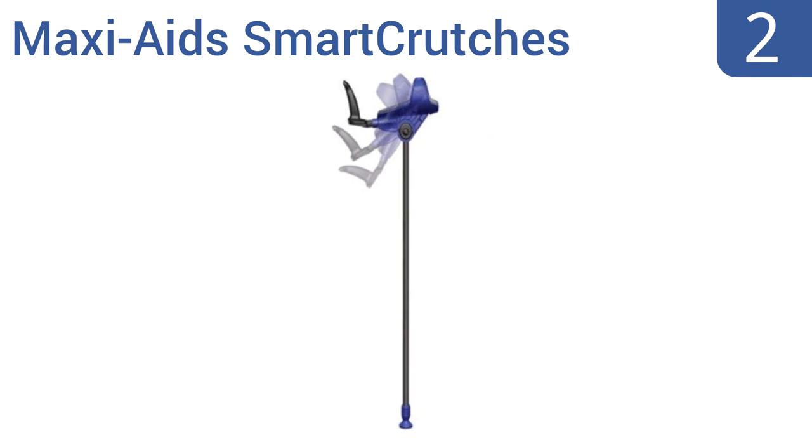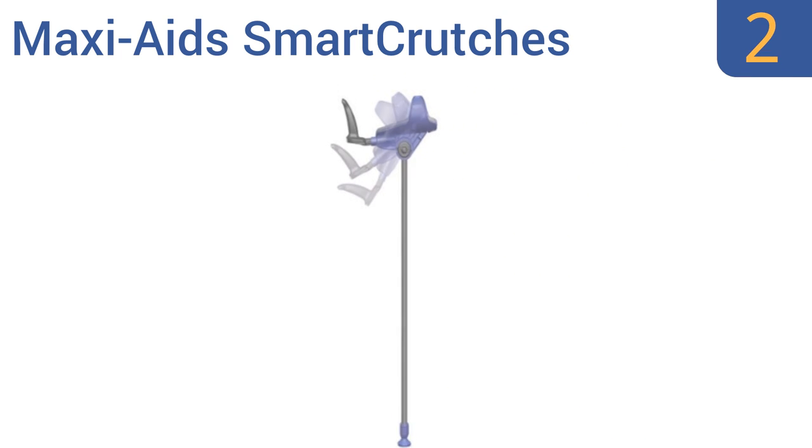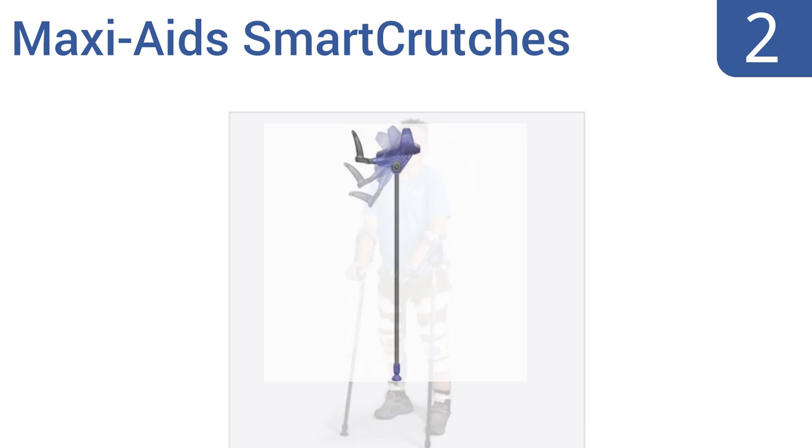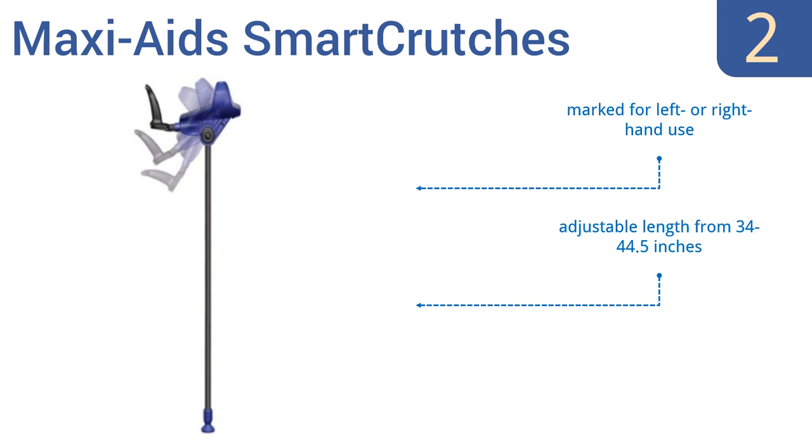At number 2. Experience the ultimate in support with this pair of Maxi 8 Smart Crutches. They deliver a weight capacity of 260 pounds, and their large padded forearm surfaces can also be angled from 22.5 to 90 degrees for superior user comfort. They're marked for left or right hand use, and have an adjustable length from 34 to 44.5 inches. They offer dependable weight distribution.